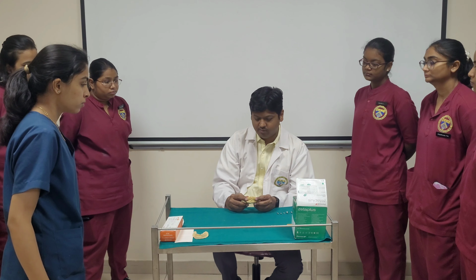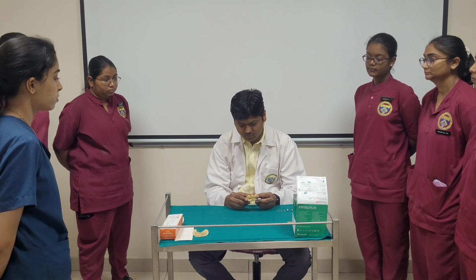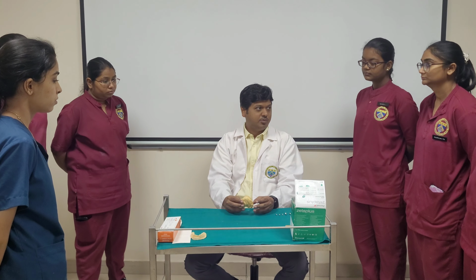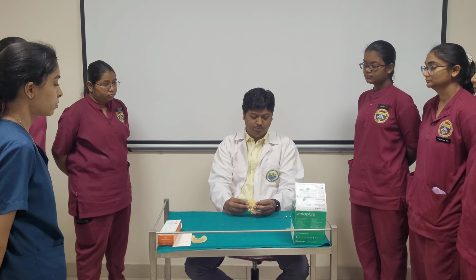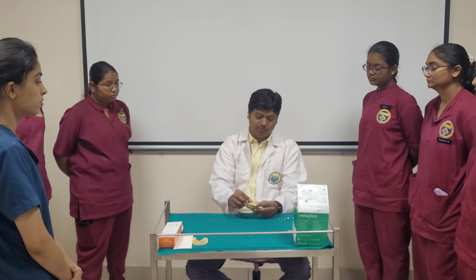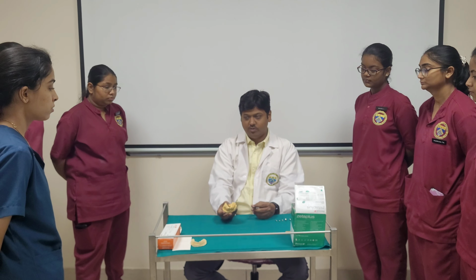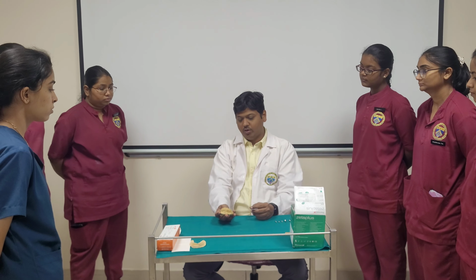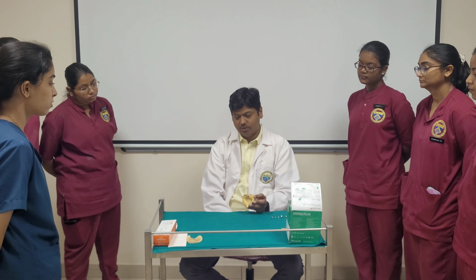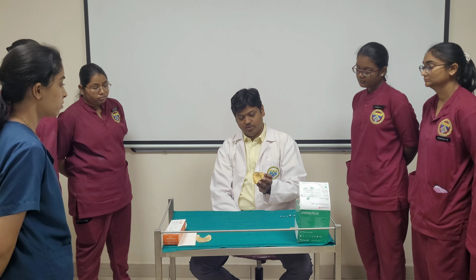So today I will be giving you a demonstration regarding the implant impression. Right? So you all know what is an implant. After placing an implant, we wait for 3 months for second stage surgery to give a crown of the implant. So this is a dummy model where you can see the implant has been placed and over that a cover screw has been inserted.